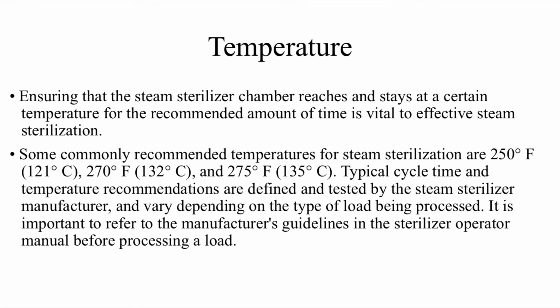Temperature. Ensuring that the steam sterilizer chamber reaches and stays at a certain temperature for the recommended amount of time is vital to effective steam sterilization. Some common recommended temperatures for steam sterilization are 250, 270, and 275 Fahrenheit.